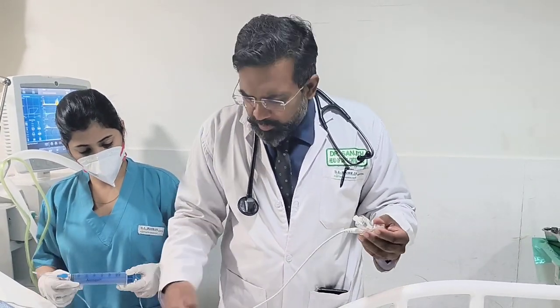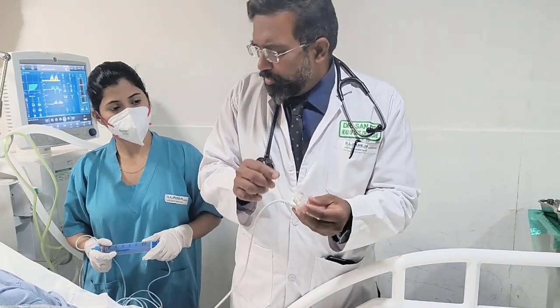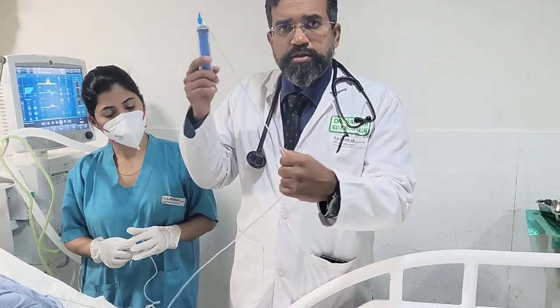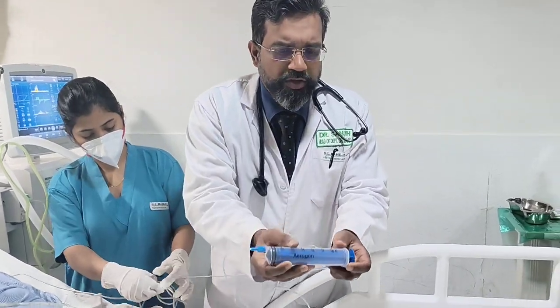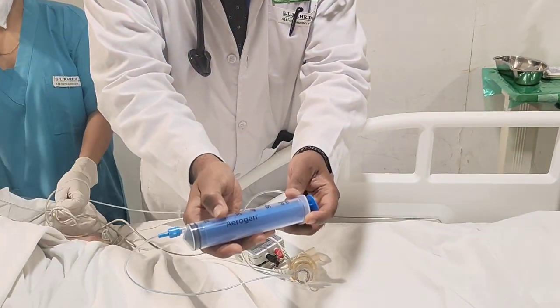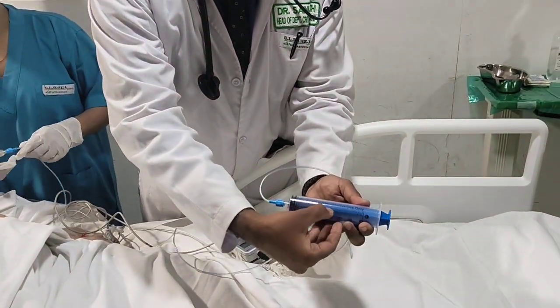Now, when you want to do continuous nebulization, what we require is this Aerogen Solo, which has this nipple and a syringe that looks like this. You cannot use any syringe that you have. You need to use this Aerogen syringe. It is written over here, continuous nebulization use only.